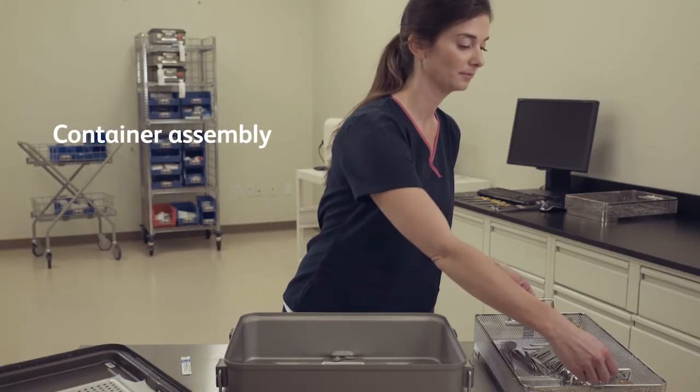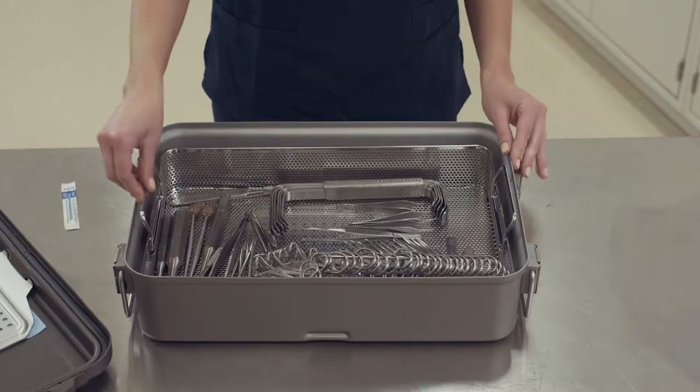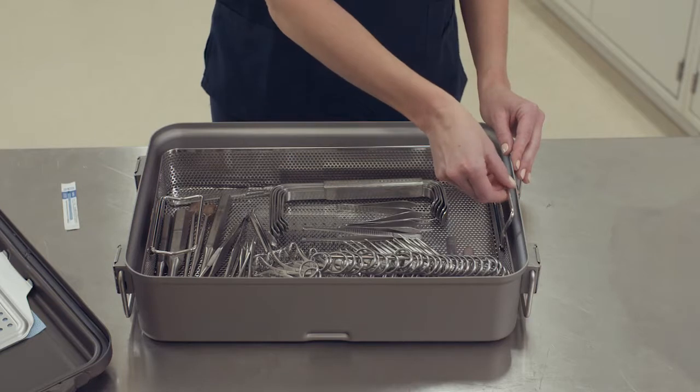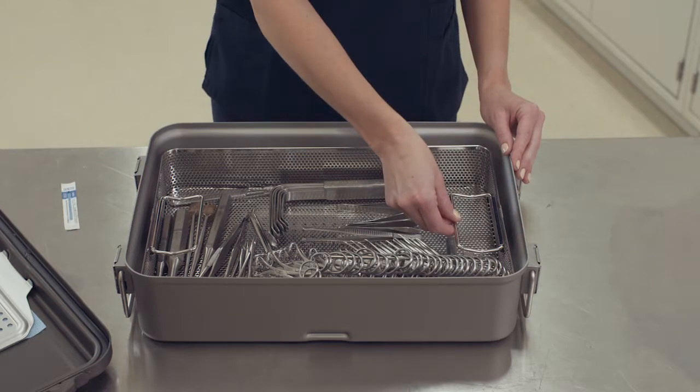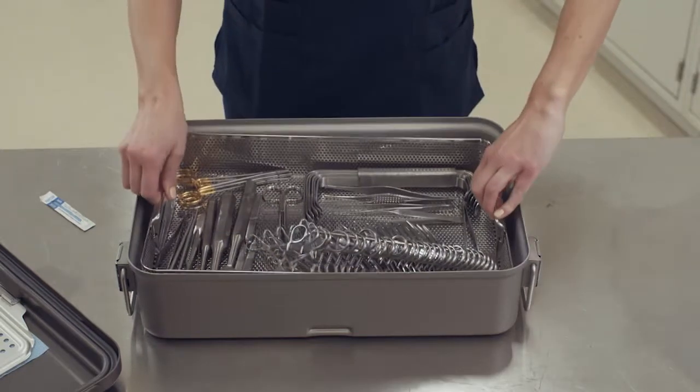To assemble the container for sterilization, place the appropriately sized basket with instruments into the container bottom. Ensure that the basket handles are facing properly. For the standard handle style, the handles should face toward the center of the basket. For the vertical handle style, the handles should be in the down position.